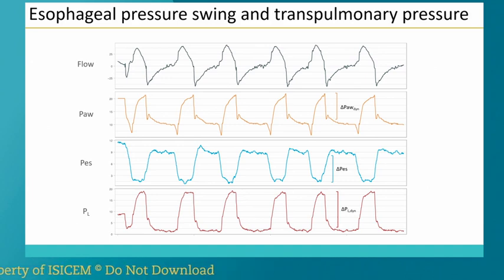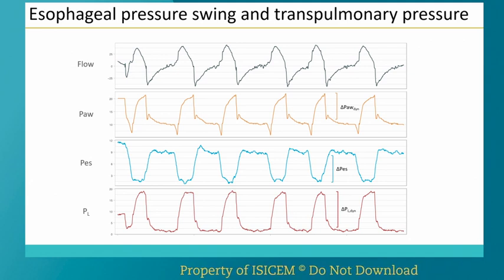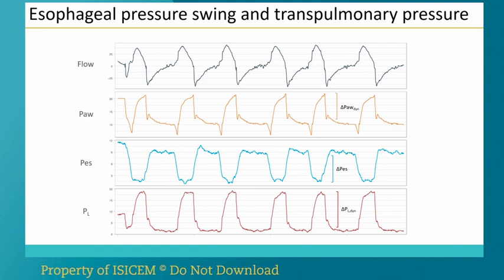A small caveat or note here, as you'll know that I'm talking about the dynamic driving pressure, which is not something that we're often used to measure in patients because we consider the risk of lung injury is explained by the static lung distending pressure, so we use plateau pressure, and this has the added benefit that it doesn't consider the resistive component of the mechanical breath, and because we think that the resistive component might not be, let's say, as important as the static component, the plateau pressure or the driving static pressure is more appropriate.